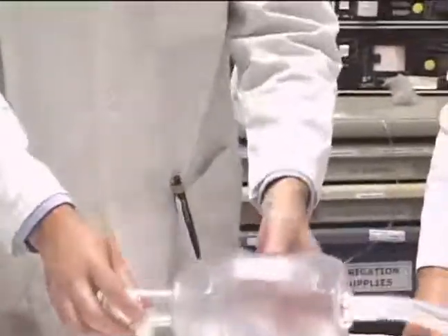We're still not getting up. Then we just need to go for it and try to actually intubate the patient. That being said, we should have planned ahead of time, if we saw a Combi tube and we were having trouble with it, to tell one of the house staff on the side, get the trach tray ready. Get the crike tray ready, get it set up, have somebody setting that up to the side, because we're probably only going to get one or at most two quick looks before we have no O2 sat to deal with here. They're rapidly going to desaturate on us. So two quick looks, see if we can get it in, and then we probably need to move to a surgical airway. So we've said in here three attempts to intubate, and that's it.